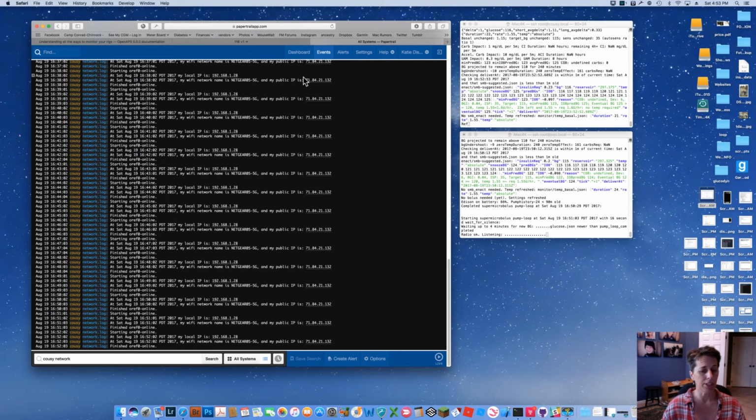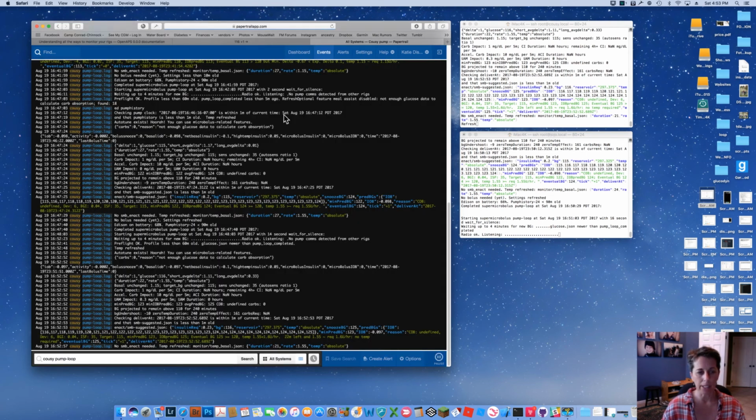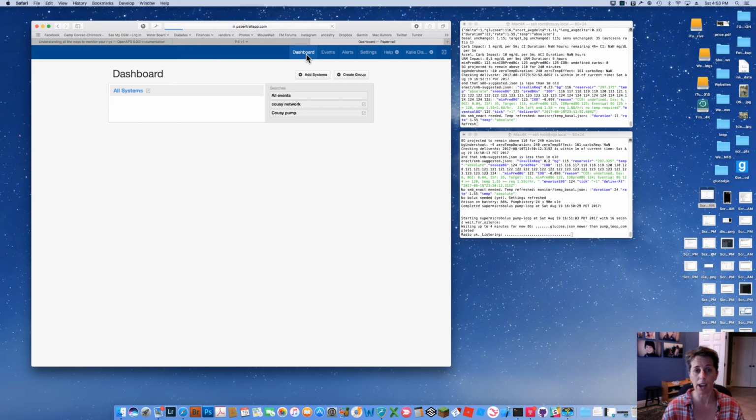And where these searches are being saved is if you go back to your dashboard, they're going to be on the right-hand side. So there's Koozie network, there's Koozie pump. If you click on those, it'll take you right to that same filter. So this is a huge tool. I recommend everybody do this, is set up searches for each of your rigs for at least the pump and network. They're super useful.